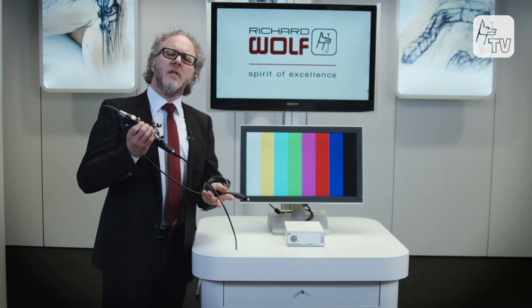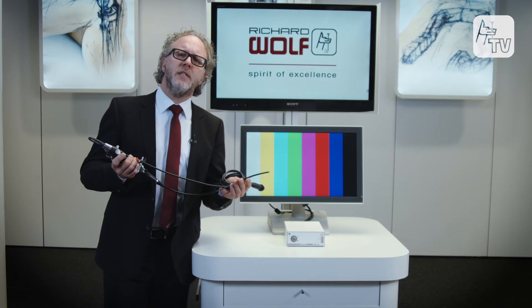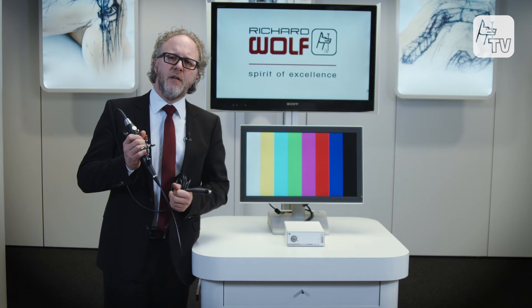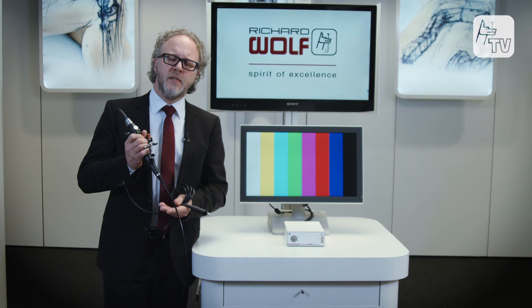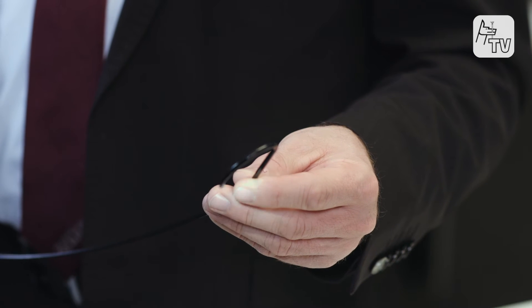We recommend our latest product for flexible cystoscopy: a flexible cystoscope with an outer diameter of 16 French, a central working channel of 7.5 French, and an articulation of approximately 220 degrees on both sides.